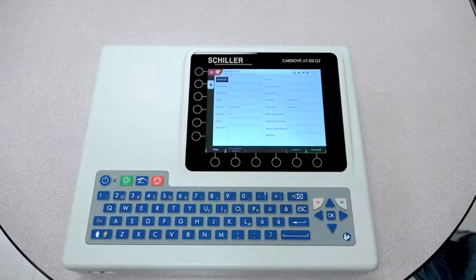Everyone. In this video, we'll be going over the basic settings of an AT102 G2.